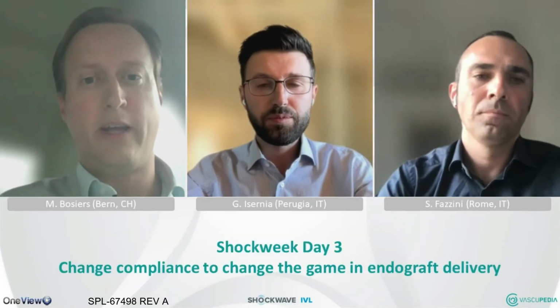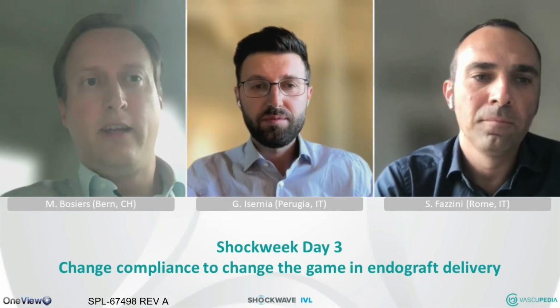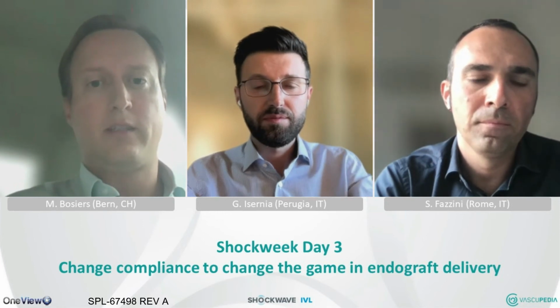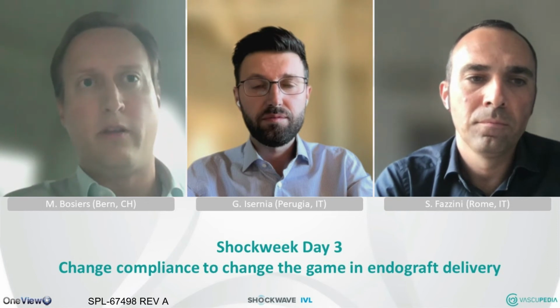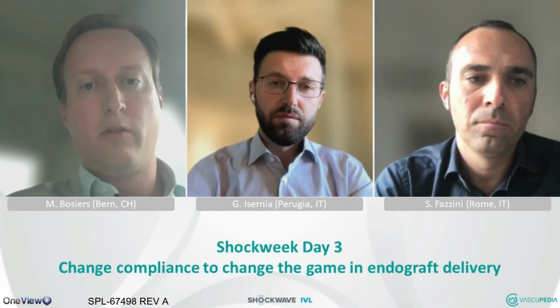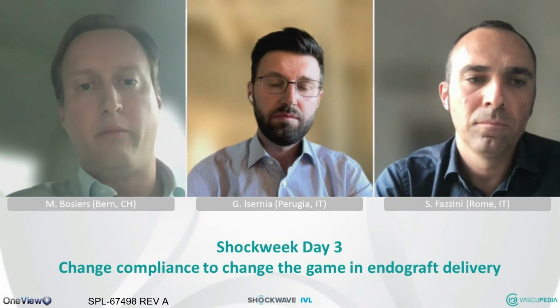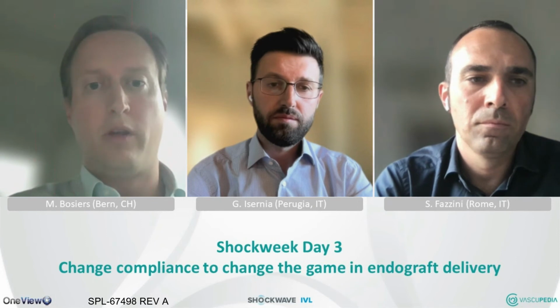Thank you, Giacomo. Also, thank you, Stefano. You've presented us with 4 excellent and very nice cases. Have you had any complications so far using this device? Because we're using this device now in large vessels. We've seen on Monday and Wednesday to treat the peripheral disease. Now we're using it to treat not only peripheral disease, iliac disease, but also before large bore access. Have you seen any complications? Because we have to go through some very narrow, very calcified, hostile access, as you showed us clearly, Stefan, at the beginning. Any complications so far?